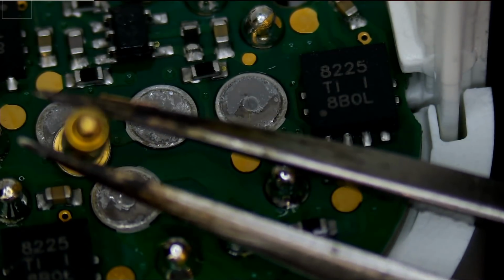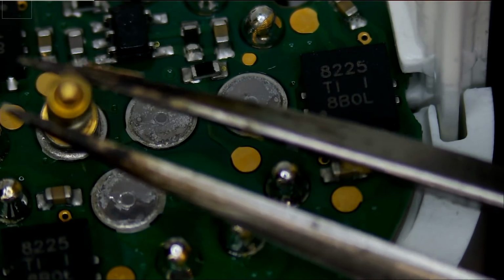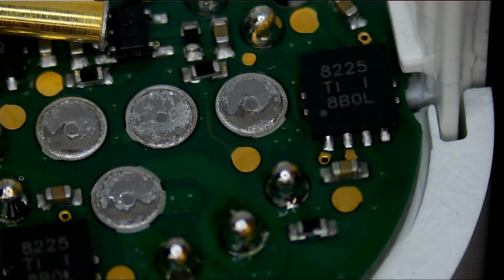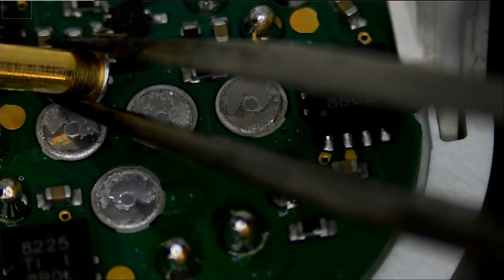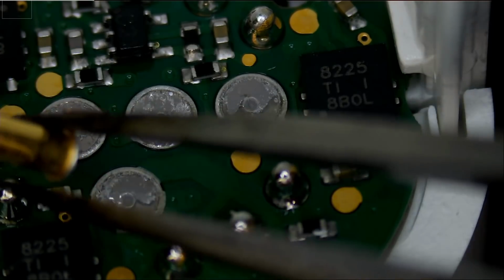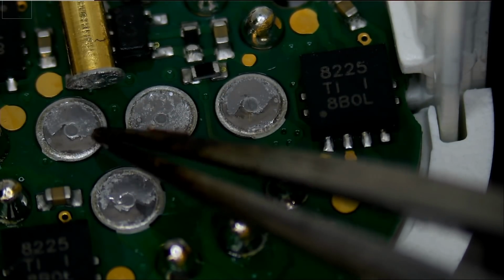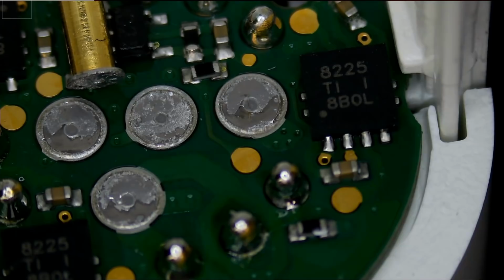They look something like this. Maybe if we grab that pin with a hot tweezer, maybe it's going to change color or it's going to deform. I do not know. So what I'm thinking is we can use our soldering iron. We're going to pre-apply solder on those pads, and we're going to position that pin vertically. And then maybe I'll point the soldering iron tip on the side of the pad. It's going to melt the solder, and solder is going to stick to the pin.